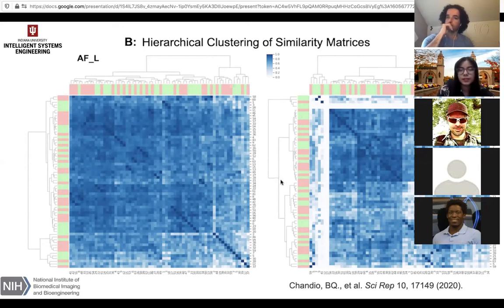So this method could be used for multiple things. If we have a registration framework, we can calculate this before and after to see how well a registration has performed, or how well a bundle extraction has performed, by comparing the extracted bundle with the model bundle.